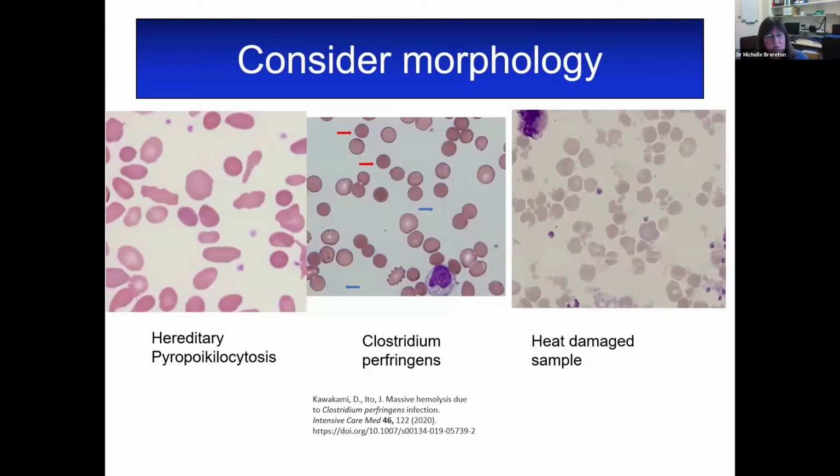So considering the morphology and the problems with the membrane, there are different cases where microspherocytes and cell budding can be seen, and they're all to do with spectrin in the membrane, which normally would keep the membrane intact. So problems with spectrin could evolve these conditions that we've got here.